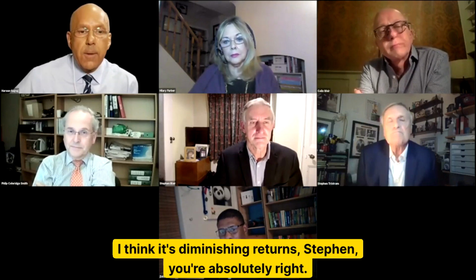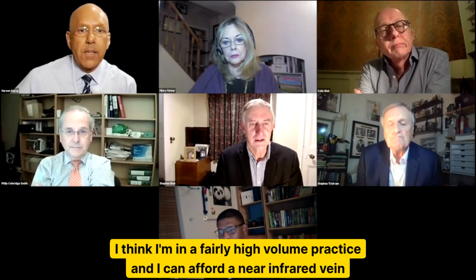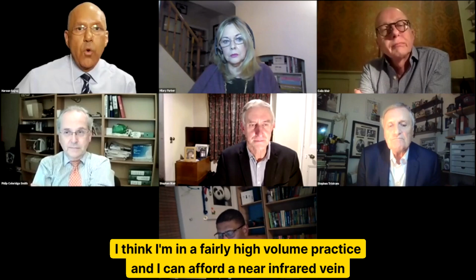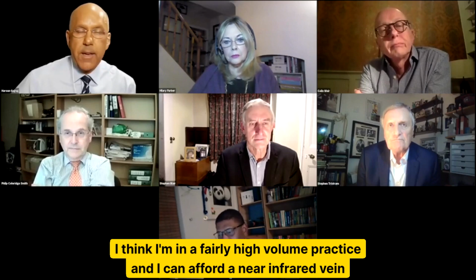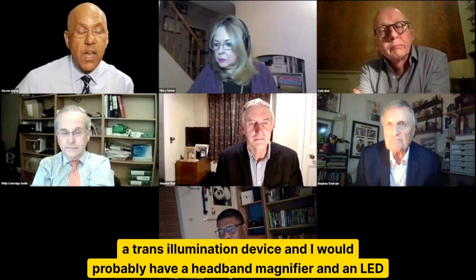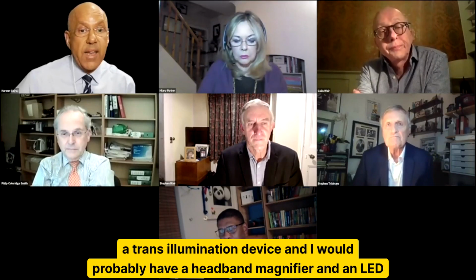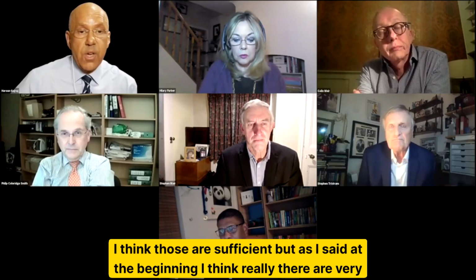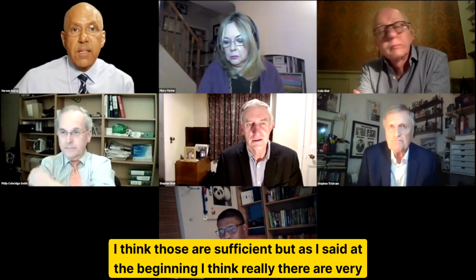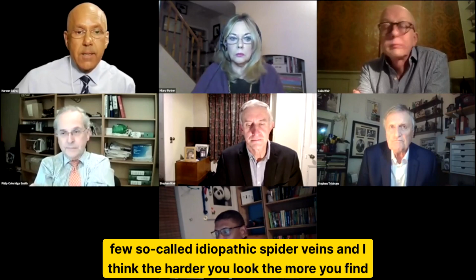I think it's diminishing returns, Stephen. You're absolutely right. I'm in a fairly high volume practice, and I can afford a near infrared vein viewer. I would have a transillumination device, and I would probably have a headband magnifier and an LED light. I think those are sufficient. But as I said at the beginning, I think really there are very few so-called idiopathic spider veins.